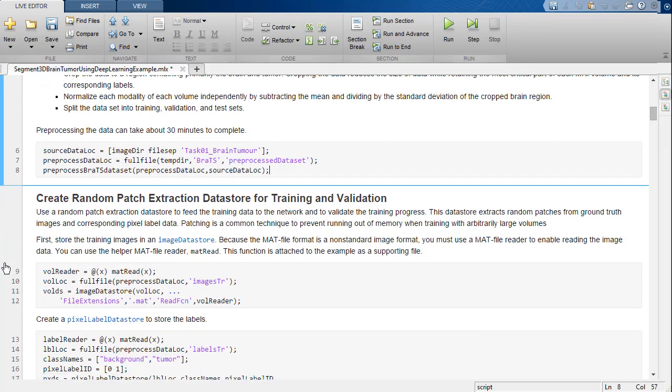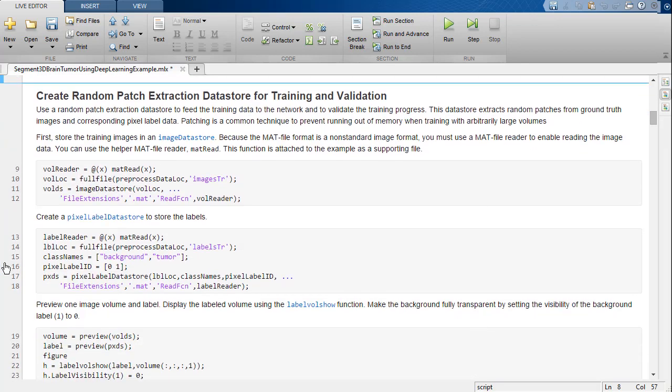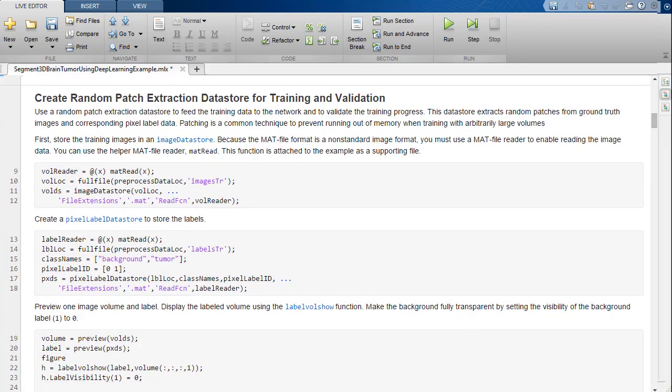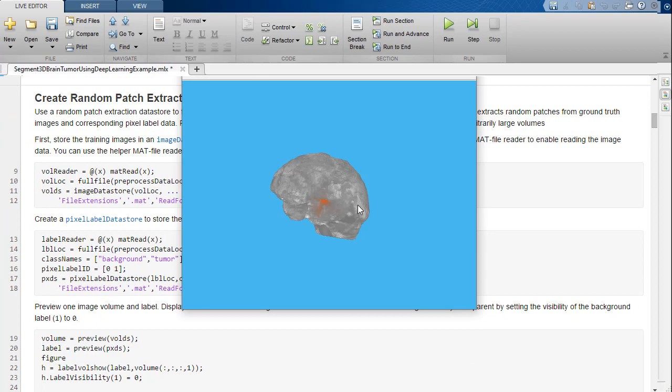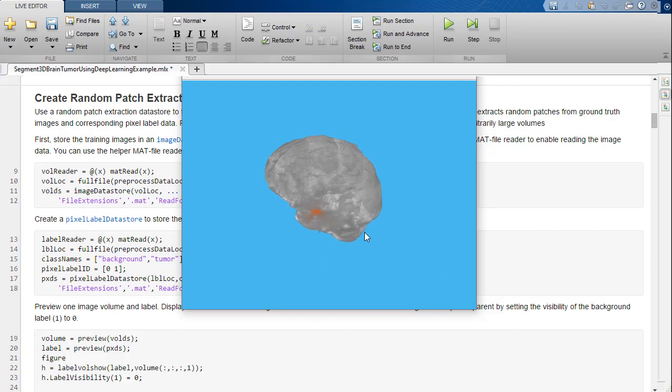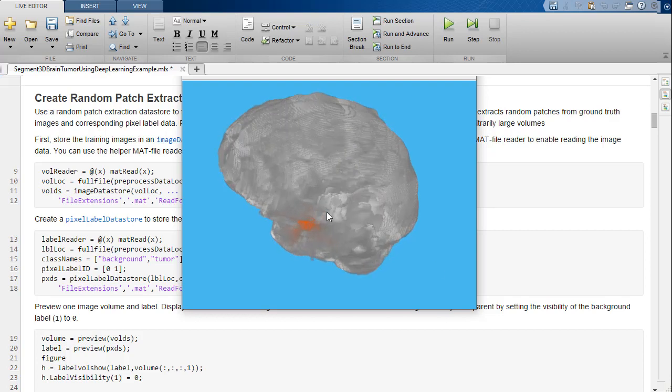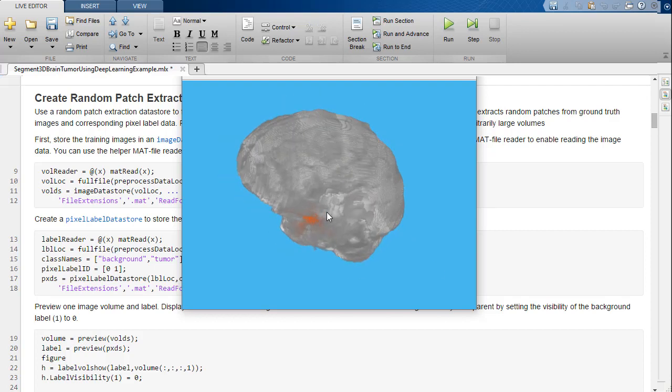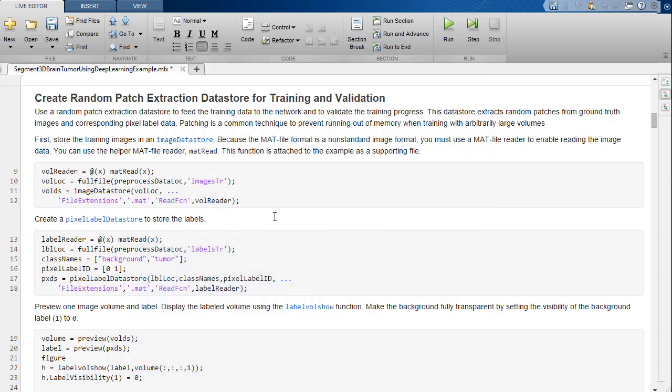We can use the labelvolshow function to preview a label training image. Because the tumor is inside the brain tissue, we will make some of the brain voxels transparent so that the tumor is visible. A voxel is the 3D equivalent of a pixel.